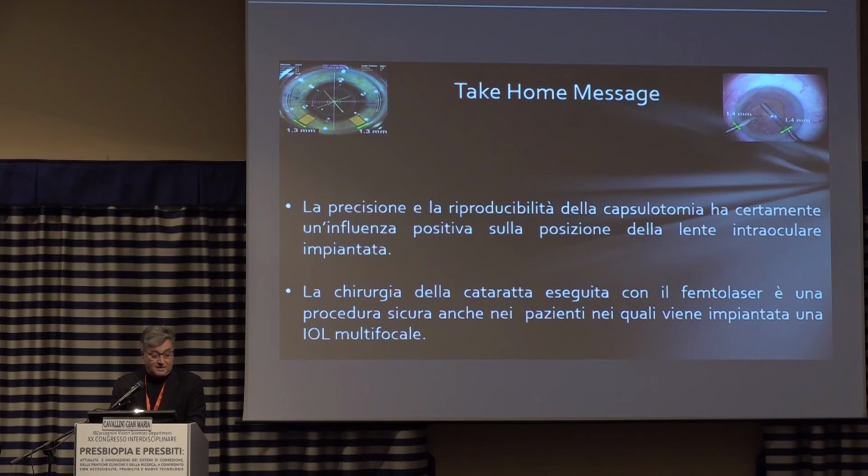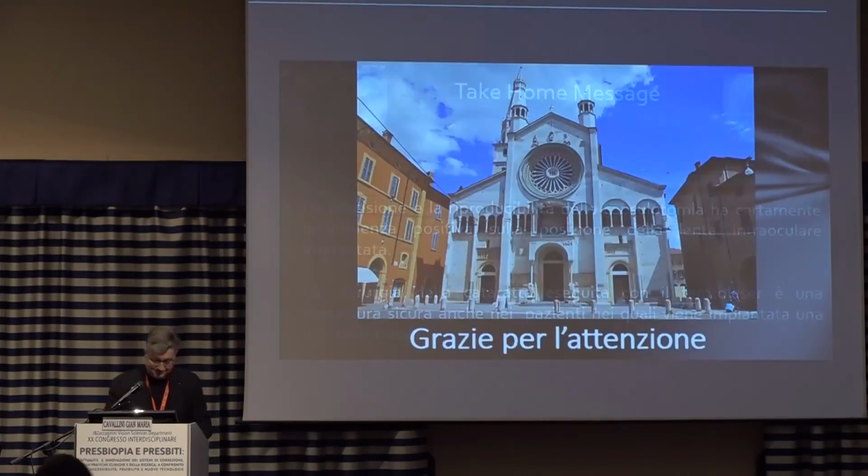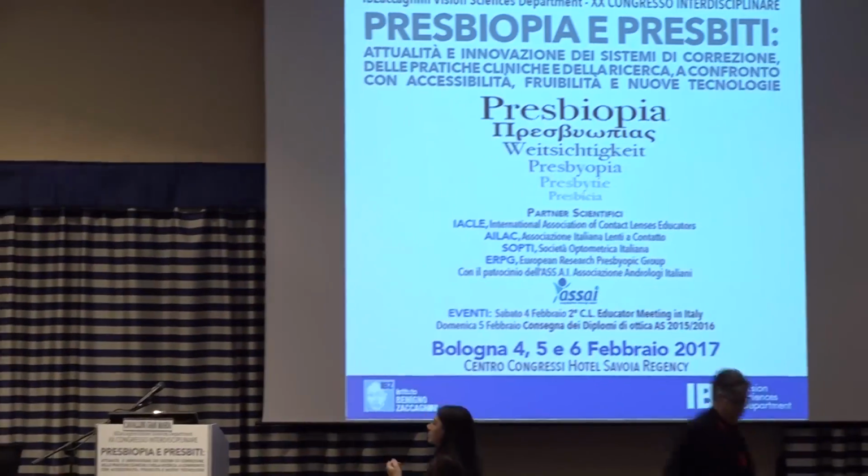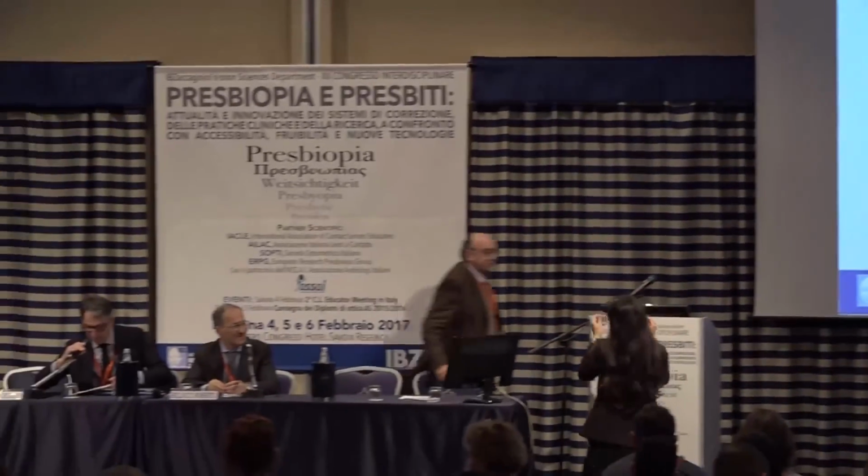Well, take-home messages. The accuracy and reproducibility of capsulotomy has a positive impact on the position of the implanted IOL. The cataract surgery with femto laser is a safe procedure also in patients where a multifocal IOL is implanted.